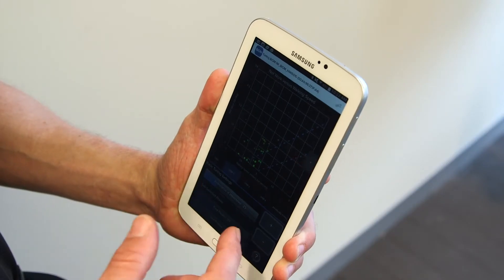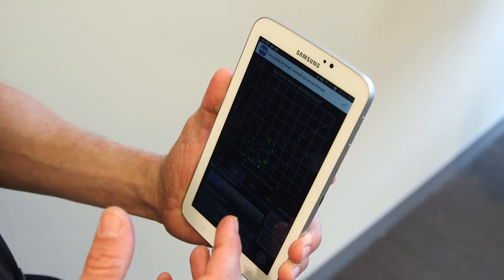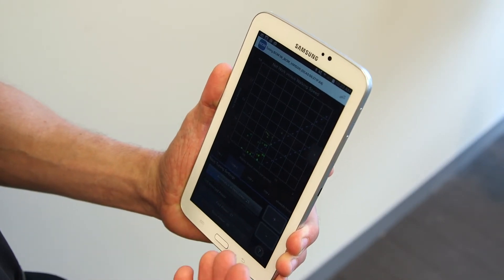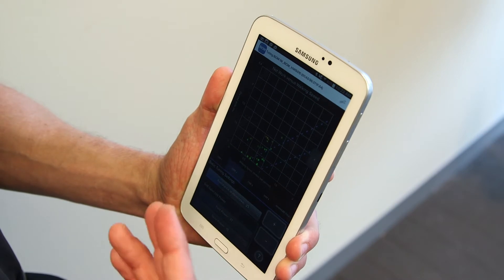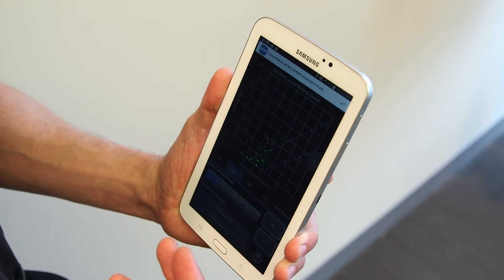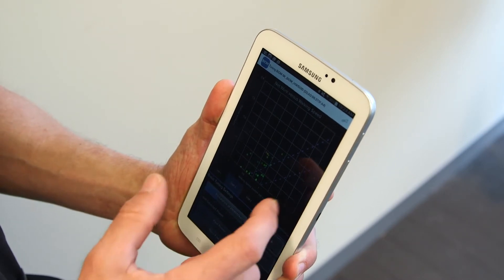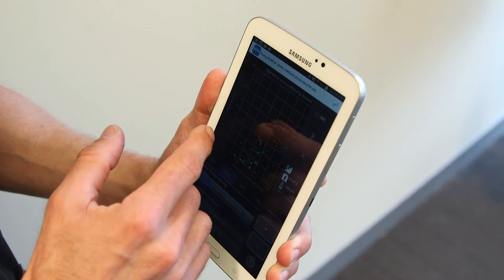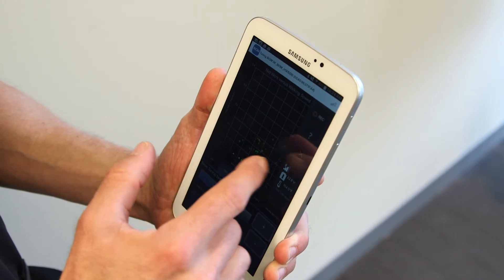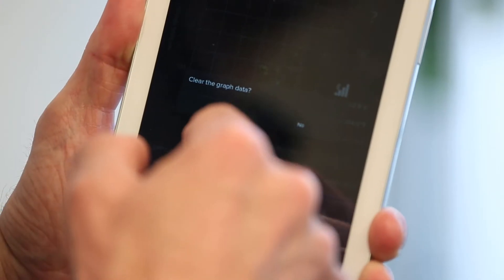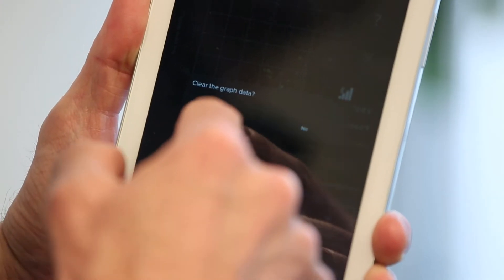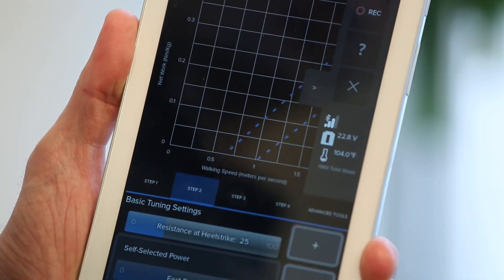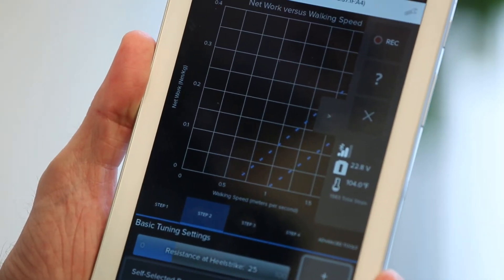If you ever get to a point where you need to start over with the tuning, or if you're testing a particular speed and you only want to focus on that speed, we can bring out this hidden menu, slide to the left, choose the X button. It asks you if you want to clear the data. We say yes, and we can see now all the steps disappear.